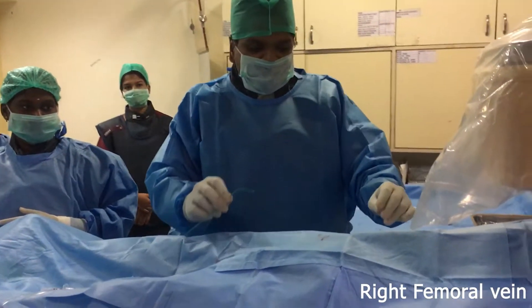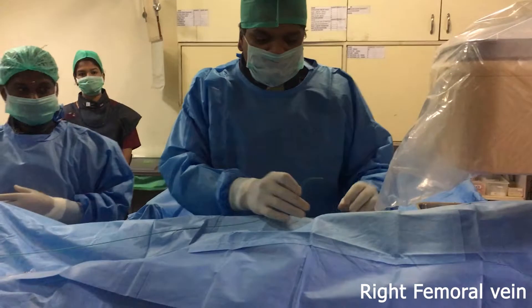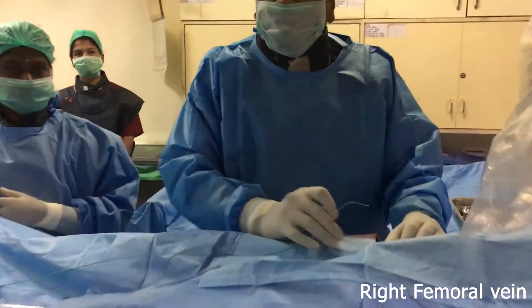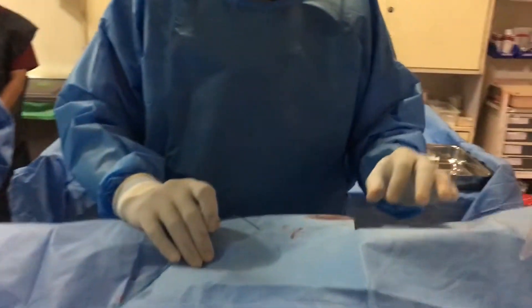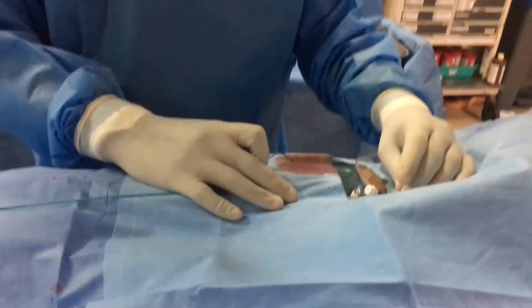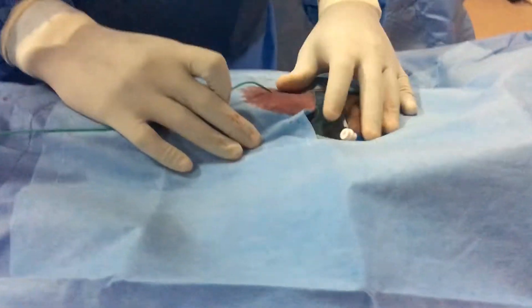Endomycardial biopsy procedure, the tips and tricks of doing endomycardial biopsy. See here, you can just focus on the groin.